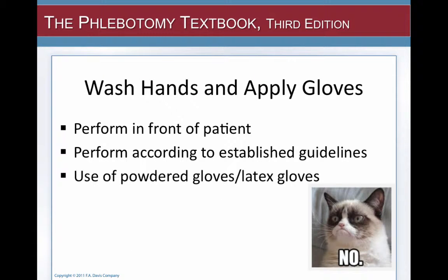Always then wash your hands and apply gloves. Perform this in front of your patient. You may want to wash your hands when you first walk into the room before you apply your gloves, and that's okay too. You just want to make sure that your patient knows that you've either washed or applied antiseptic to your hands. You do not want to use powdered or latex gloves. Grumpy Cat says no. And that's because you're trying to eliminate any allergies to latex gloves. And also, we don't use powdered gloves in the lab anymore because a lot of times they irritate the phlebotomists' and the laboratory workers' hands.